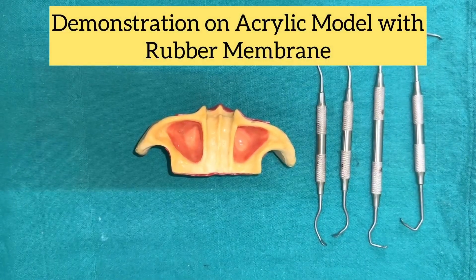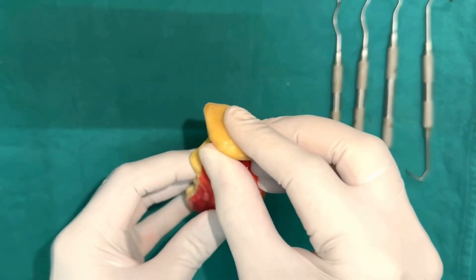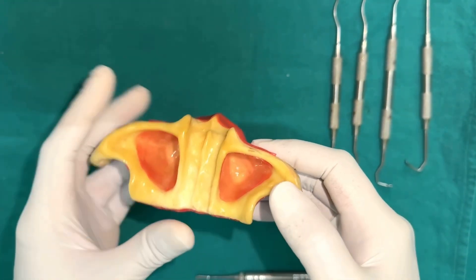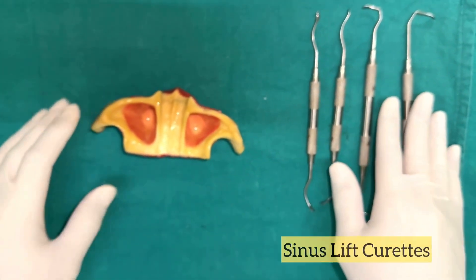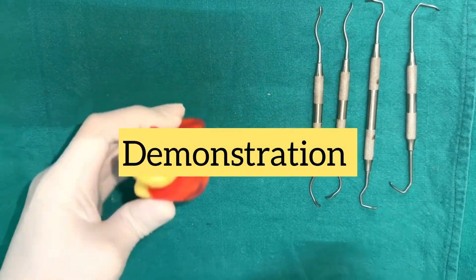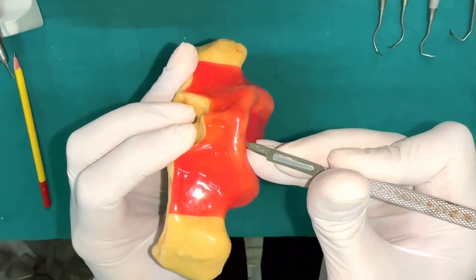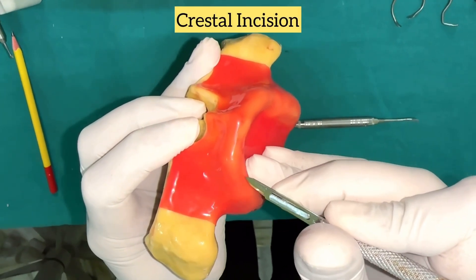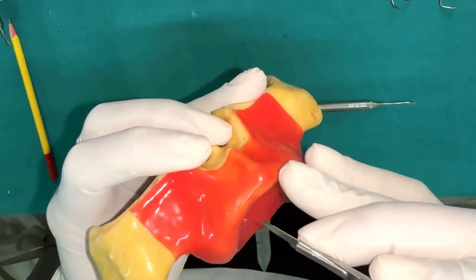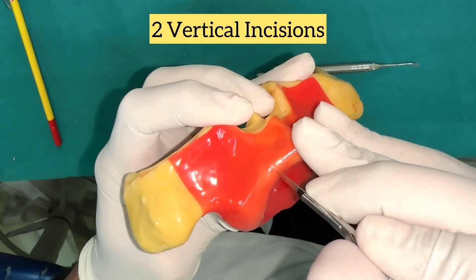Starting with our demonstration of direct sinus lift on this particular model — we will be demonstrating direct sinus lift in this area, and this is how the model looks from inside. These are our sinus lift curettes. First and foremost, we are supposed to give a crestal incision in the area of the tooth from where we require bone augmentation to be done. After the crestal incision, we give two vertical incisions.